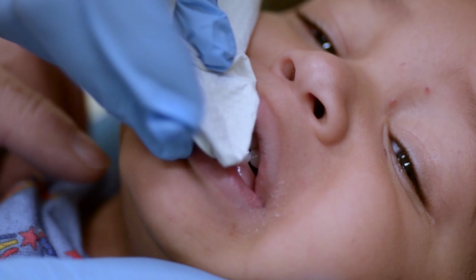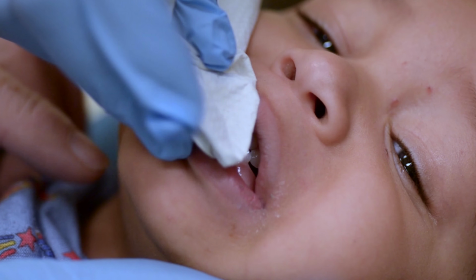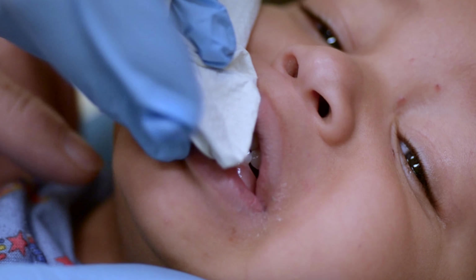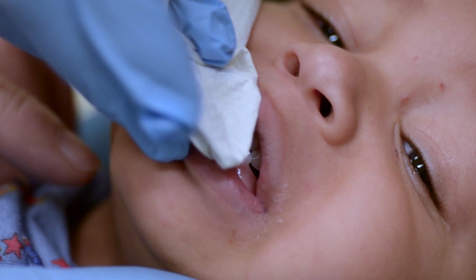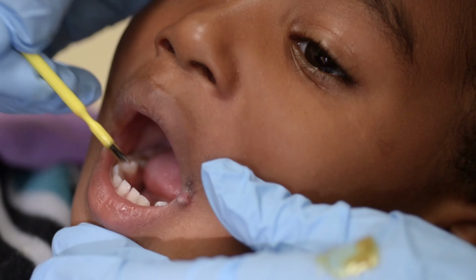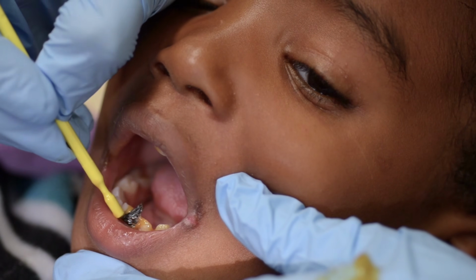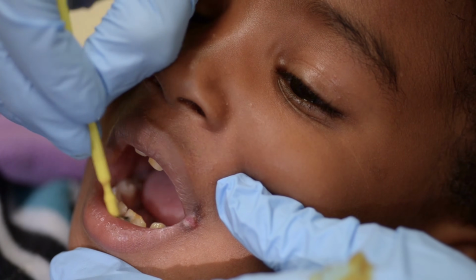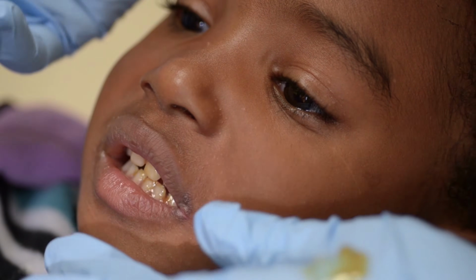Use the gauze to dry excessive saliva from the tooth surface before painting the varnish. It is okay if some saliva is still there, as the saliva fixes the varnish to the tooth surface. Paint all the surfaces of the teeth, both the front and back of each tooth, and be sure to paint the chewing surfaces of molars.